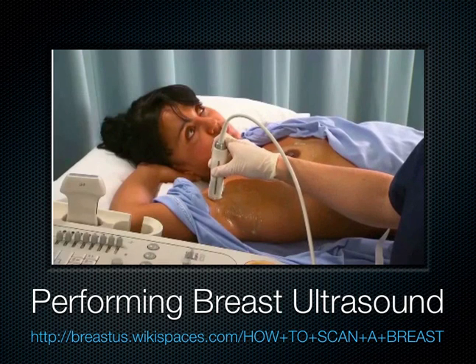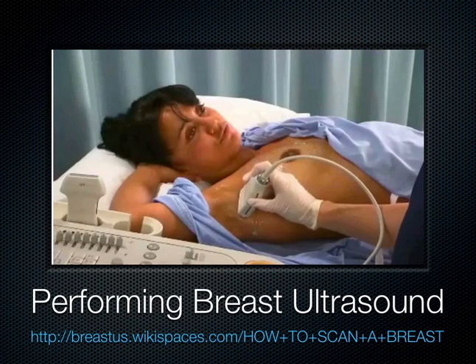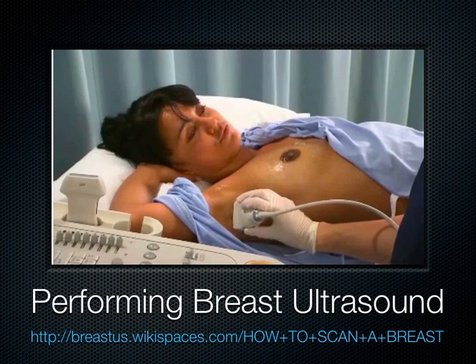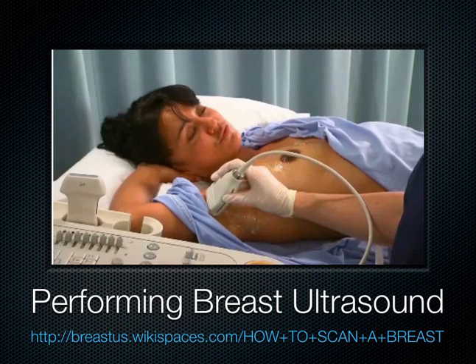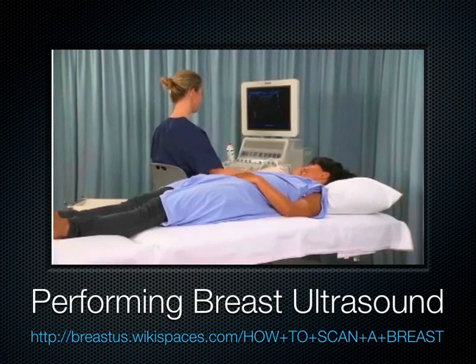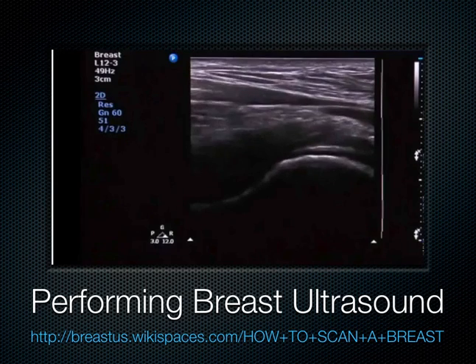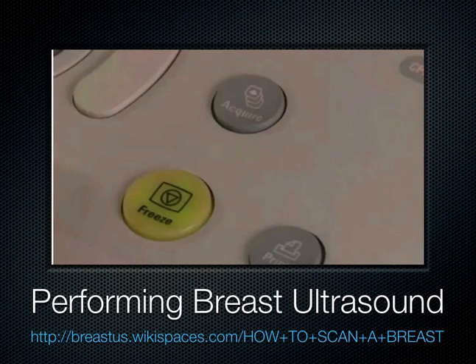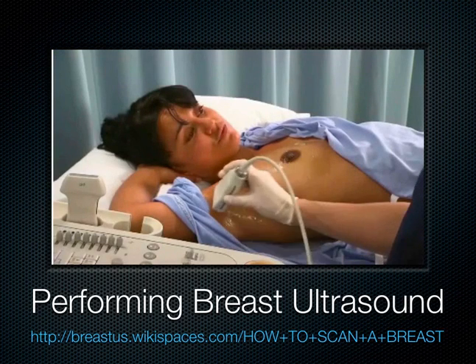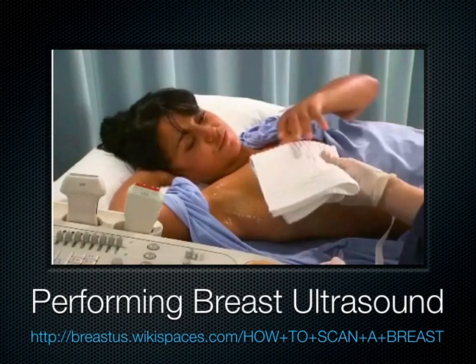Place the transducer in the superomedial aspect of the axilla in a transverse position. Slide inferiorly, then laterally, and finally superiorly until the whole axilla has been examined. Return the transducer to the midline in the longitudinal plane. Optimize the image, then freeze, annotate, and save the image. Repeat the process in the transverse plane. Give the patient a towel or cloth to wipe off the gel.